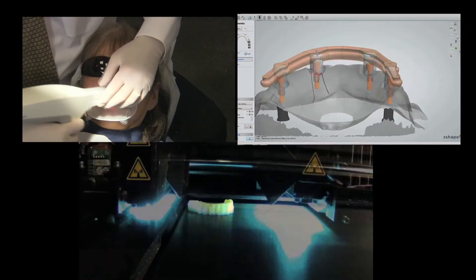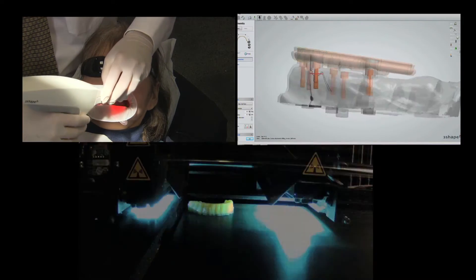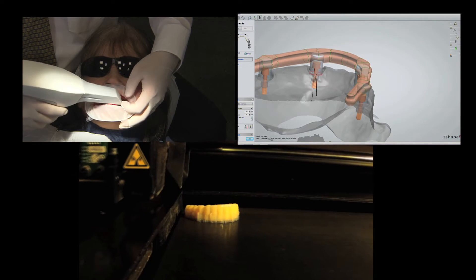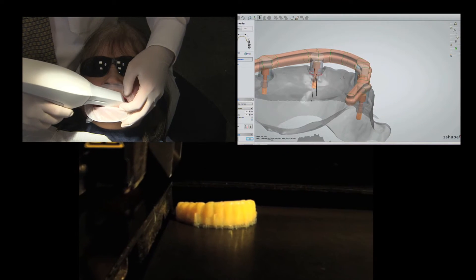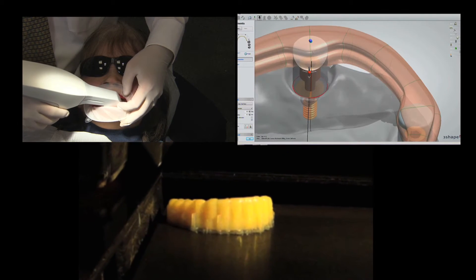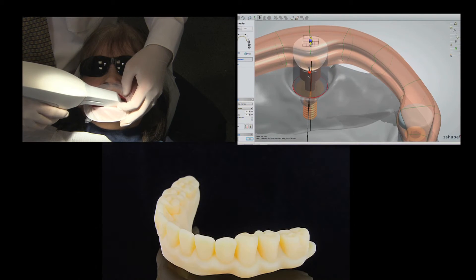The patient had a very stable bite and was free of TMJ symptoms throughout the entire healing phase. The final restoration protocol made use of intraoral scanning, dental CAD-CAM, and 3D printing to deliver the final prosthesis in just three appointments.